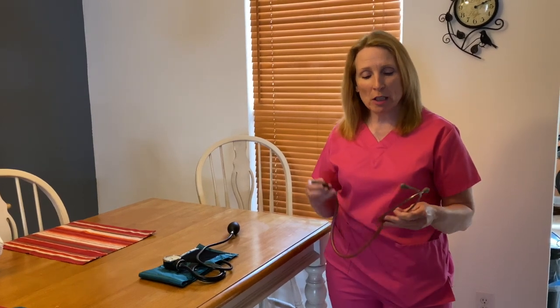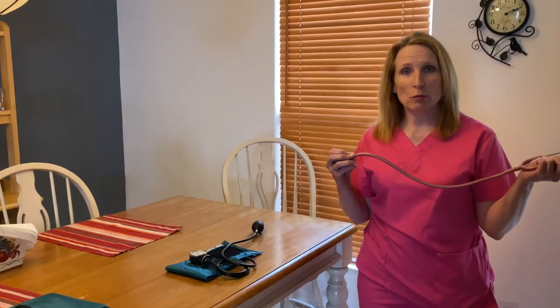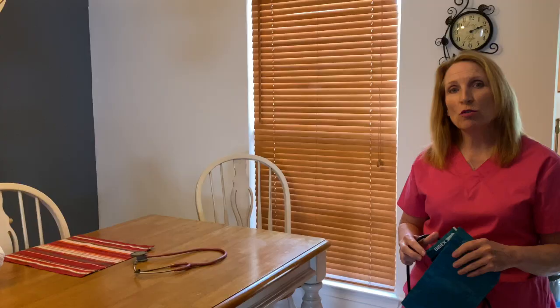So first of all, I'd like to introduce our equipment. All of you by now should have your own equipment because you have picked it up from school or you have purchased your own. So of course I have a stethoscope, okay, and I have a blood pressure cuff. You need these two things to start it out. So make sure you have your supplies ready.